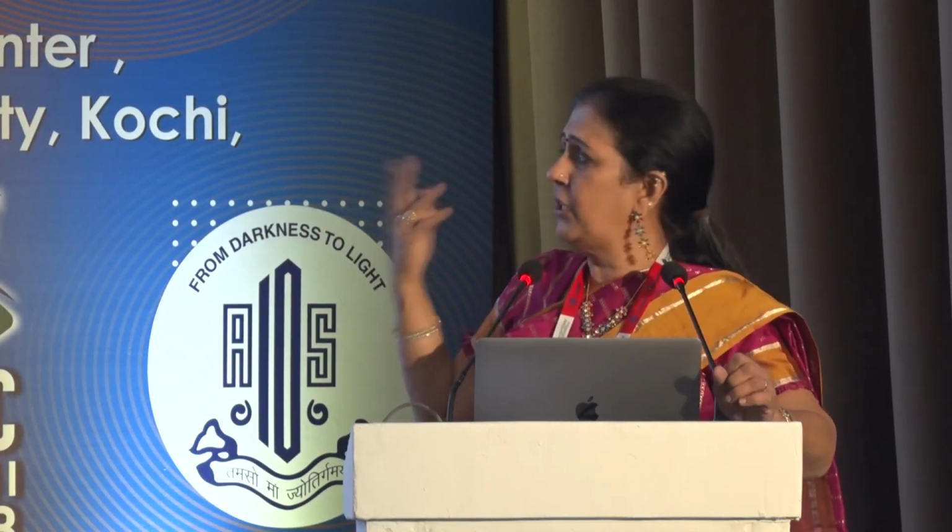And these are cases of late subluxations, which can happen either from inadequately treated primary surgery or a progressive zonulopathy, wherein you need your vitreoretinal surgeon to get the lens out and a glued IOL could be placed. So there are different ways with which you can skin a cat when it comes to subluxation. But the idea is we need to understand what is the kind of zonulopathy and treat it accordingly. Thank you very much.